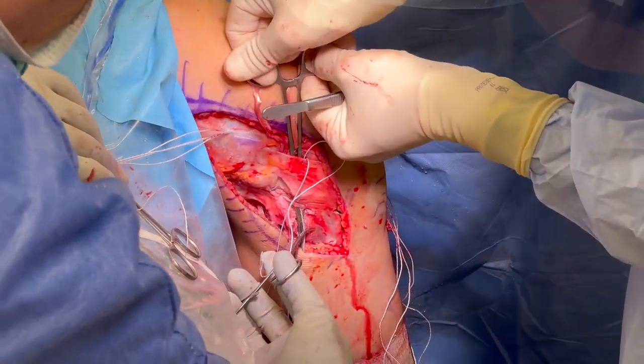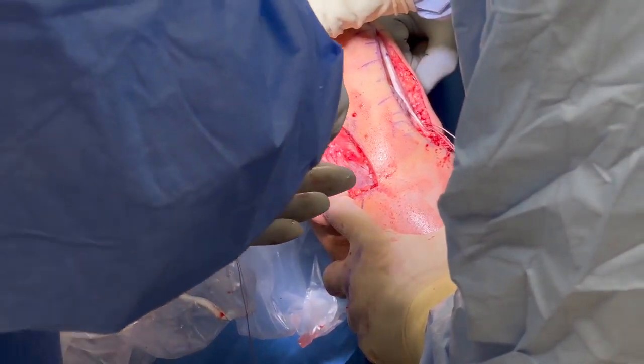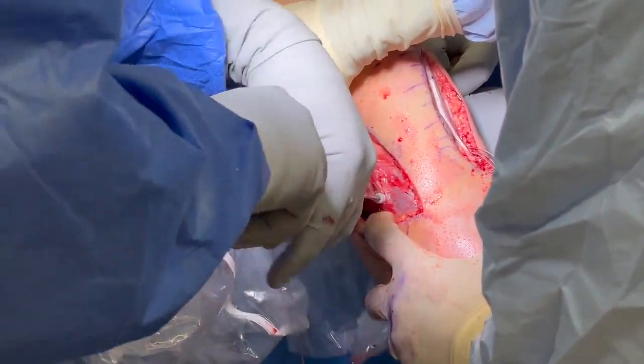The FCL graft is pulled through a channel under the superficial tissues and passed through the fibular tunnel. The knee is positioned in 20 degrees of flexion, neutral rotation, and a slight valgus force. The graft is secured with a 7 by 20 millimeter bioabsorbable screw.